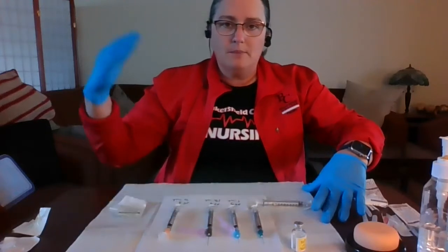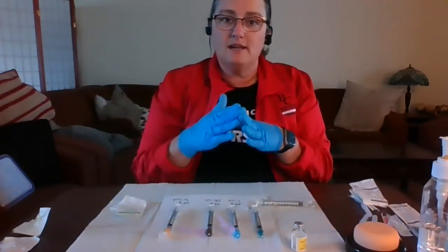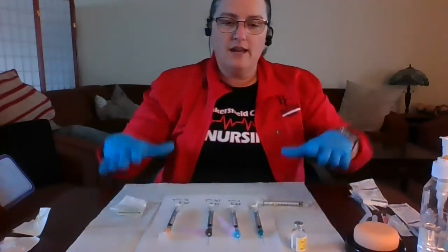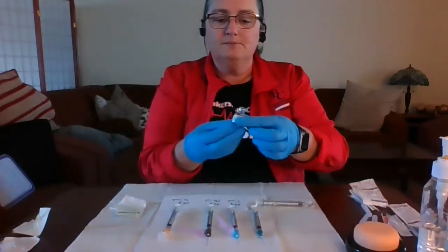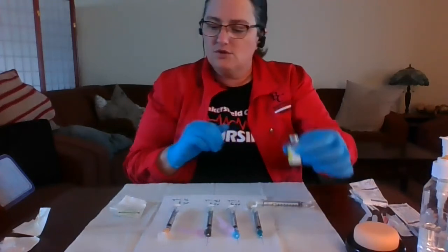Usually there'll be a pop-up tent or a table or something that you can use, and the person that is preparing the vaccines will be in control of that space. So something to clean the area, something to lay down underneath to stay organized. Again, you have your vial of the vaccine or whatever it is that you're going to be administering.